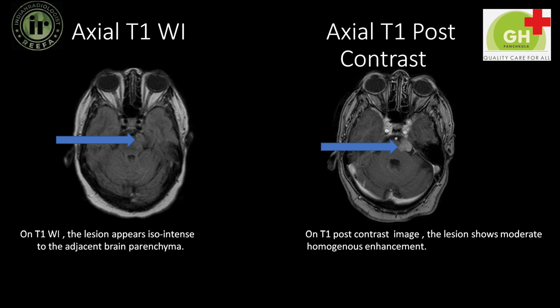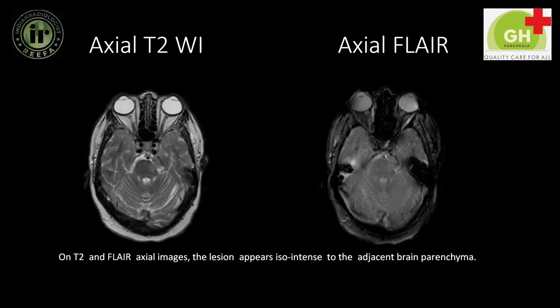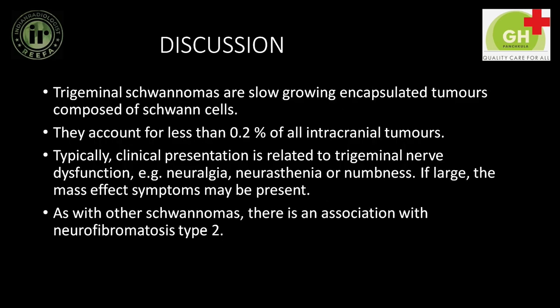On T1 weighted imaging, the lesion appears iso-intense to the adjacent brain parenchyma. On T1 post-contrast image, the lesion shows moderate homogenous enhancement. On T2 and FLAIR axial images, the lesion appears iso-intense to the adjacent brain parenchyma.